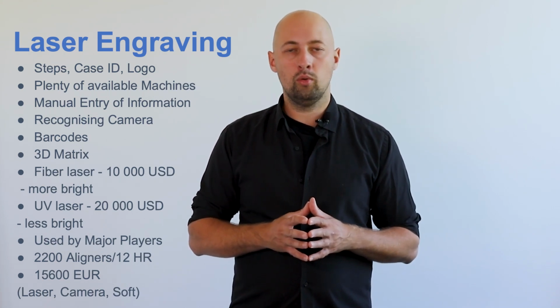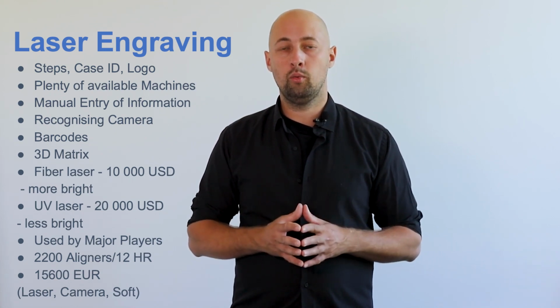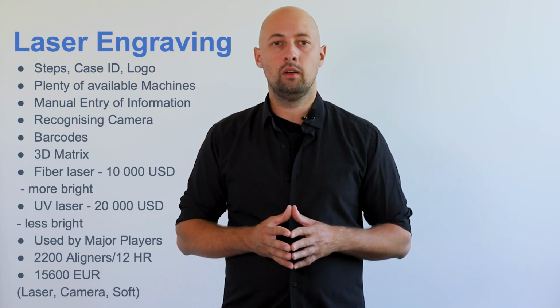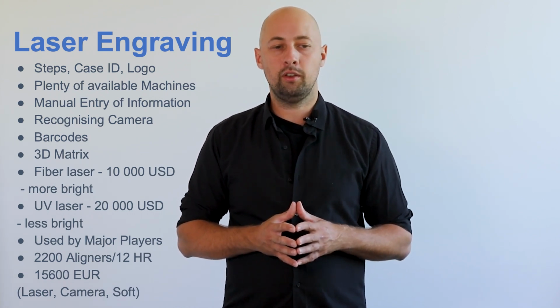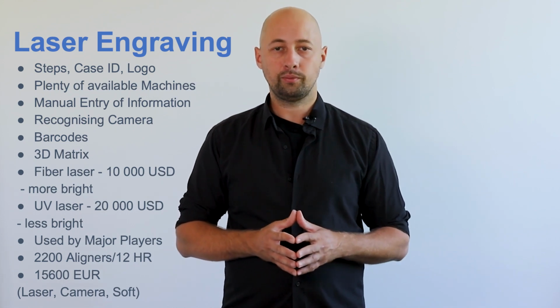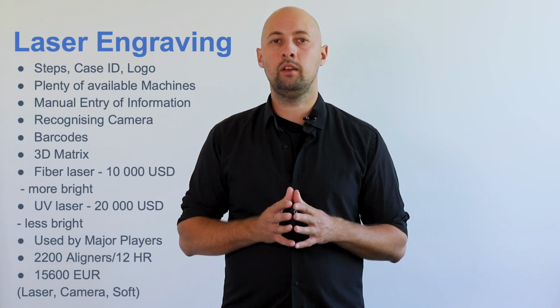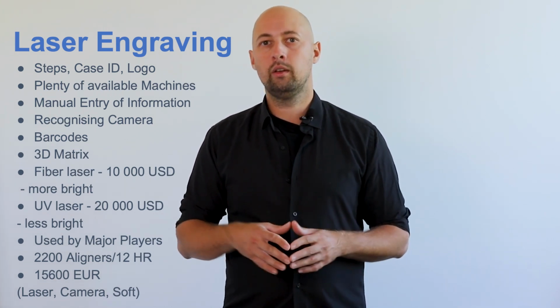By using this technique, you can mark up to 2,200 aligners per 12-hour work shift. And if you want to purchase this module from Exceed, it will cost about 15,600 euros. Again, no shipping, no custom declaration. This is just a laser, camera, and the software. Very important to mention that you also need this technique if you want to implement the automated polishing, and I will tell you why in a minute.